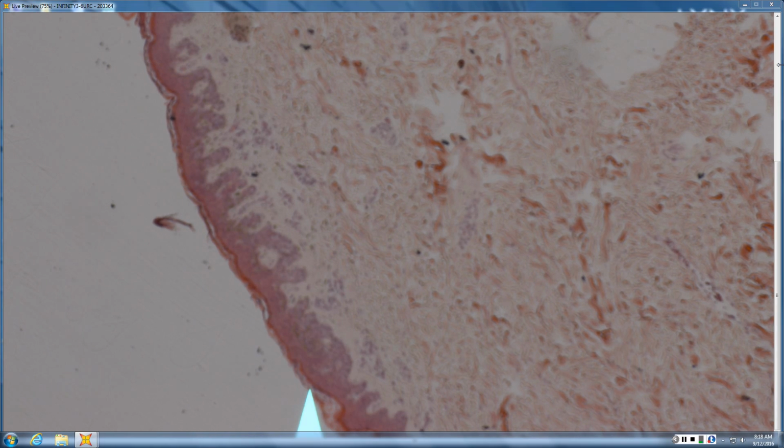For acral melanomas, the rules are different. You don't see confluence usually. You don't see big nests. What you have is maybe in your big sizable biopsy, you may see 8 melanocytes if you're lucky. But they're hyperchromatic, they're angulated, and their arms are all different sizes. So they have this big pigmented dendrite here, this little dendrite there. They're weird. You know, big dendrites, little dendrites, angulated, hyperchromatic cells at the DE junction on acral skin. They don't belong there. It's trouble. What you're not going to see is buckshot scatter.